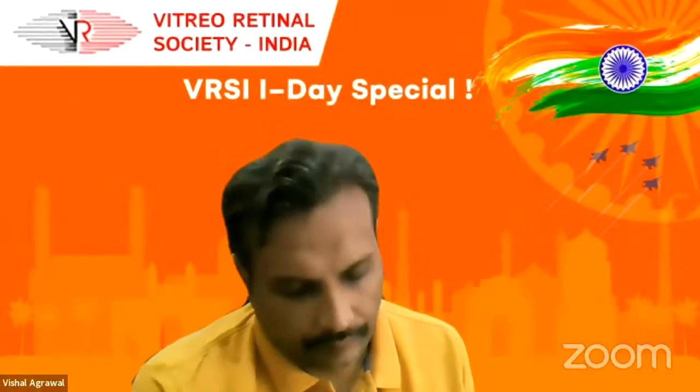Any thoughts, Dr. Charles? Yes, two. One, I thought the surgery was elegant. I thought the video was phenomenal. The only difference is that I would always use brilliant blue, not ICG, because of the known toxicity of ICG. The only other comment is that I would not make a ring of laser around the optic nerve head because of the risk of nerve fiber layer damage. Even though the visual outcomes that you presented were quite good, I would specifically treat an identified tear if I could. But I think the ILM flap is a superb idea.